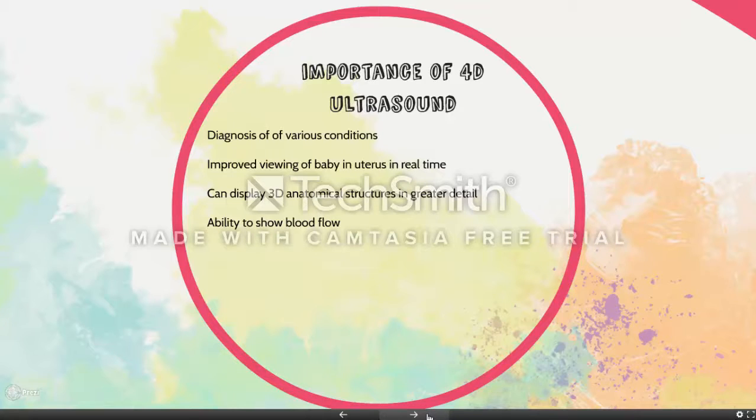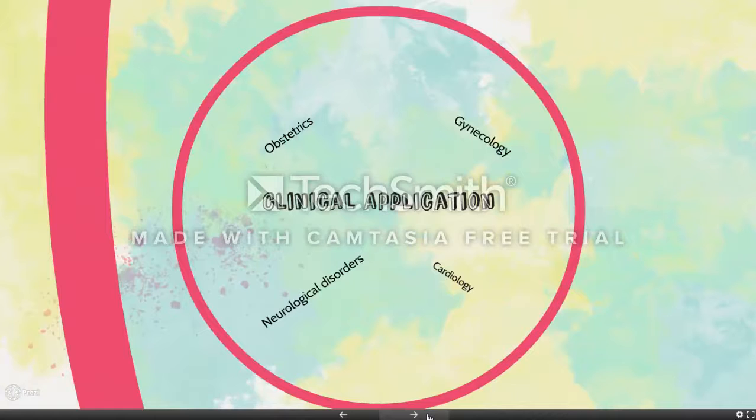Further, surface rendered images can display anatomical structures in 3D, thus providing greater delineation and greater visual detail of any internal lesions, and it can also demonstrate the nature of cavities, thus overall providing greater clarity than 2D images. Moreover, 3D colored Doppler imaging is able to show blood flow within tissues. This ability to show vascularity of tissues is significant for the assessment and diagnosis of disease and high-risk pathological changes in an individual. Here are some applications of 4D ultrasound that can be applied in the clinic.